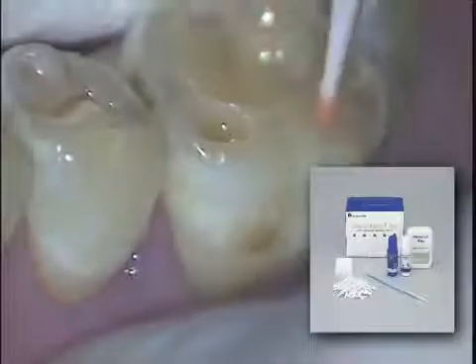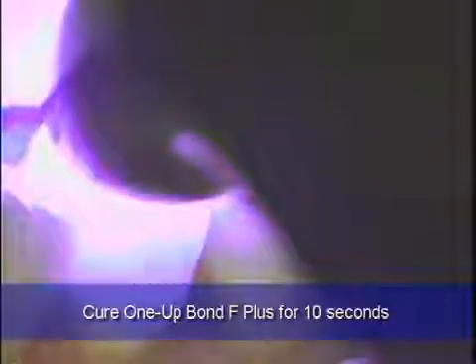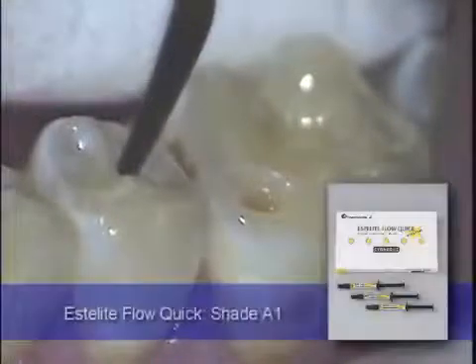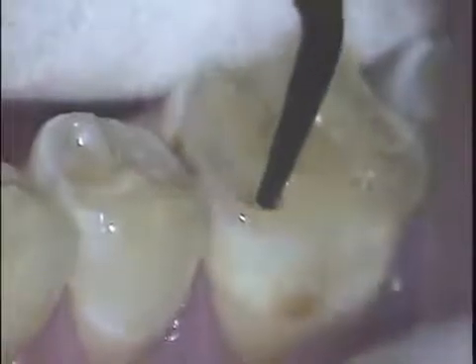The 1UP Bond F Plus is scrubbed on the tooth surface for approximately 10 seconds. There is no need for separate etching or a primer bond, as the 1UP Bond F is a self-etching primer bonding agent in one step, and light cured for an additional 10 seconds. Here, the Estelite Flow Quick is placed incrementally in 2 mm layers in the tooth cavity preparation.